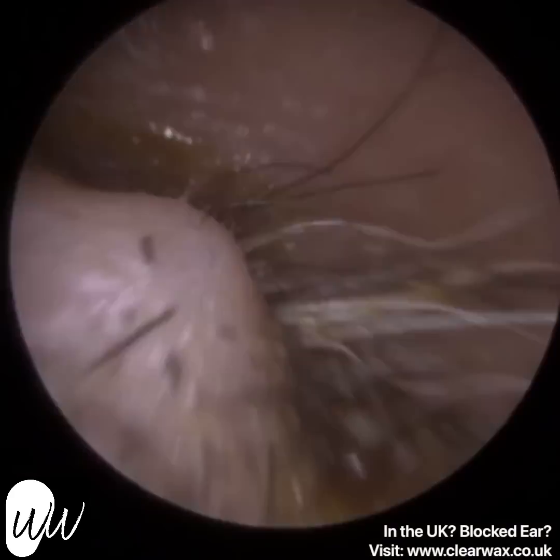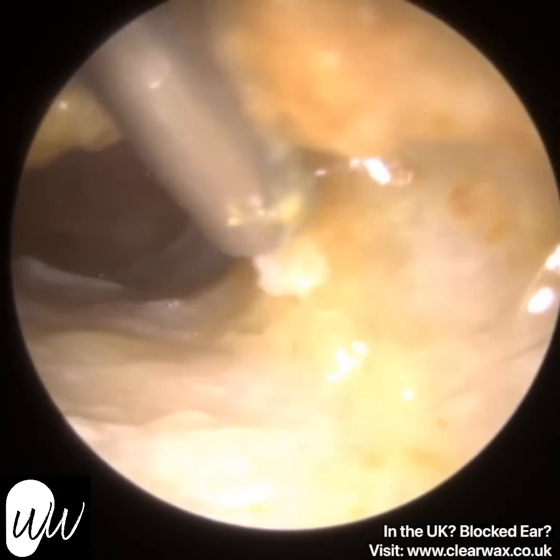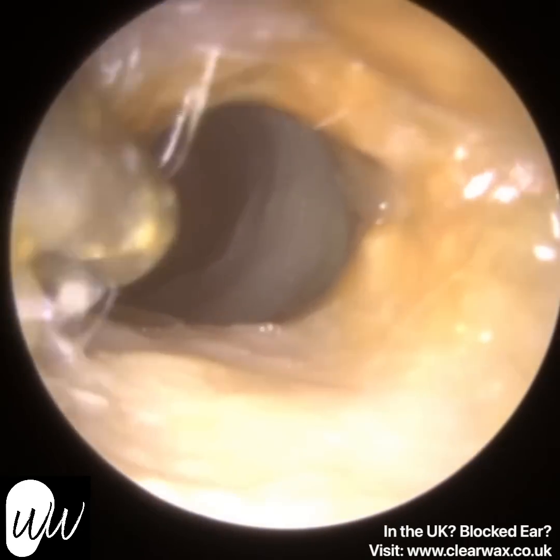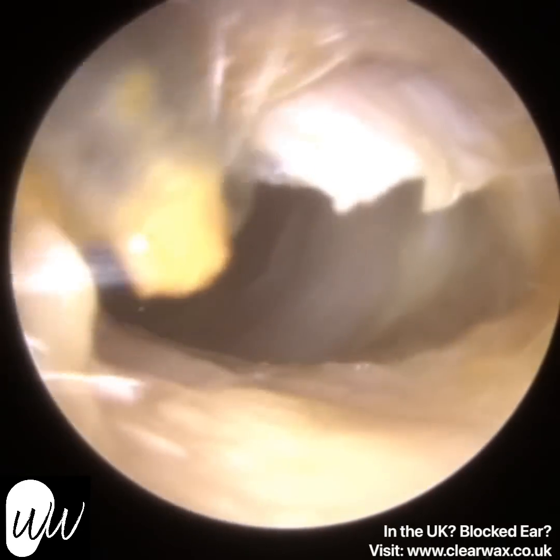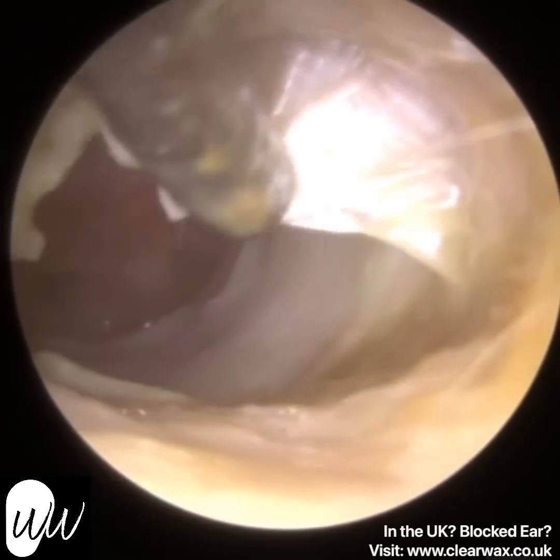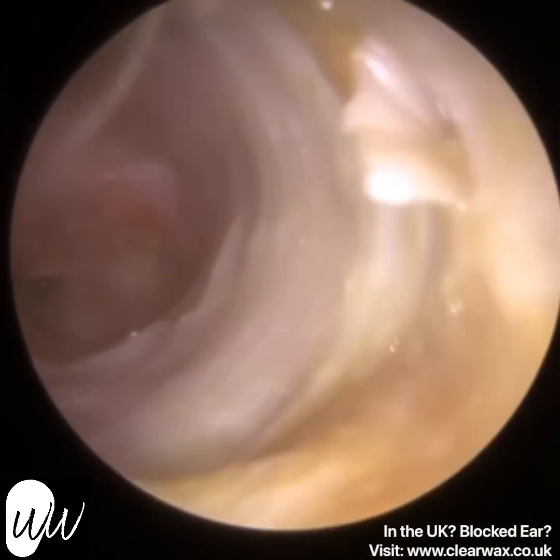And I think that was the occlusion removed. It's all this wet debris around the edge, so I'm going to mop that up. There's a lot of dead skin as well coating the medial part of the ear canal. So when we say medial, we mean closer to the eardrum and further away from us, the clinician. As you can see, there's dead skin on the posterior canal wall, so the back part.